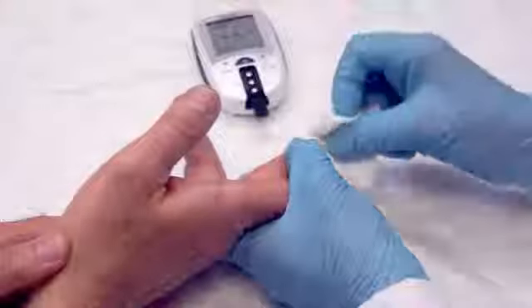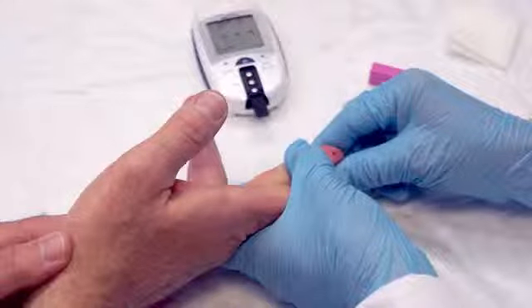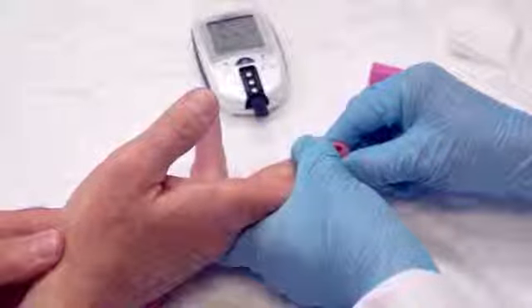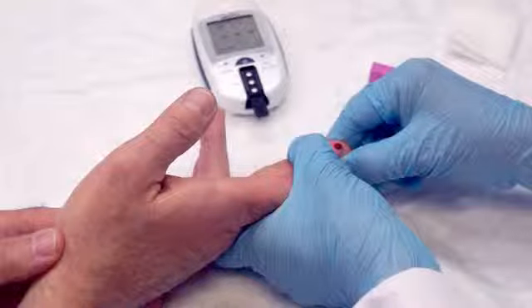Use the sterile gauze to wipe away the first drop because it may be contaminated with interstitial fluid or debris. Squeeze the finger to obtain a second large drop of blood. Do not milk the finger. If necessary, continue to massage finger to increase size of the drop.